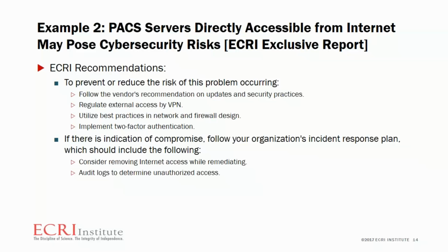However, you need to always identify the related clinical workflow impacts that may exist if you suddenly disconnect a device from the network. So finding the best way is highly dependent on your individual organization and how that particular device is used.